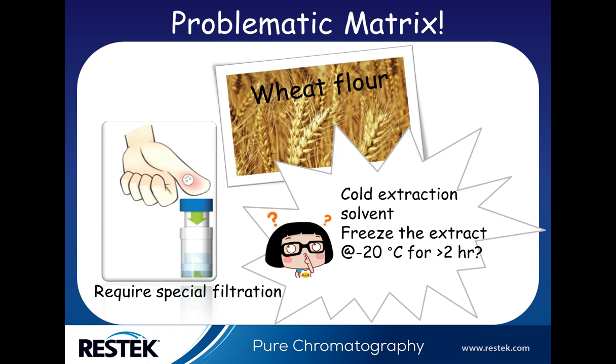Then you probably have questions for me, like, okay, so far you've had successful results with your method. Have you ever gone through any problematic matrix or obstacles? Yes, I do. I didn't show this in my publication, but I can share the experience with you here. It is the wheat flour. This wheat flour gave me problems when I was doing the Thomson filter. It hurt my thumb because of the pressure you can feel.